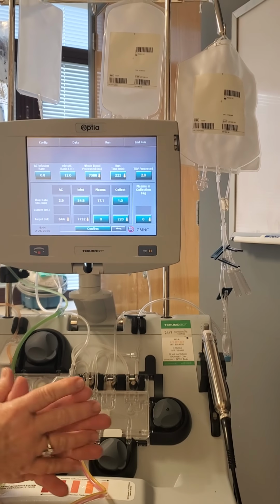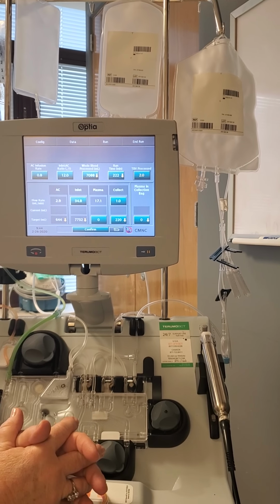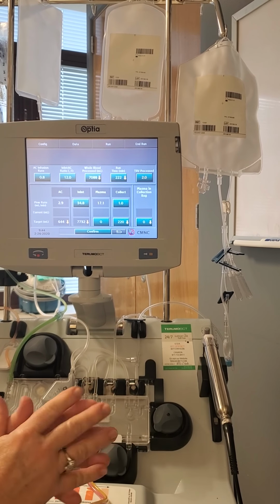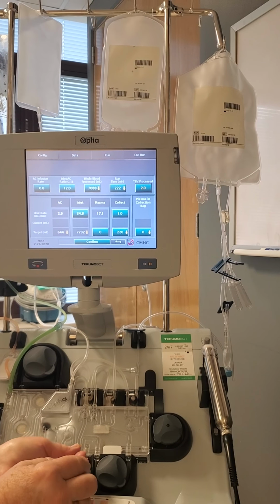And there's really nothing you have to adjust here with respect to starting up the procedure, unless the way you practice changes or you've got a different order for a different amount of whole blood to process. Okay?